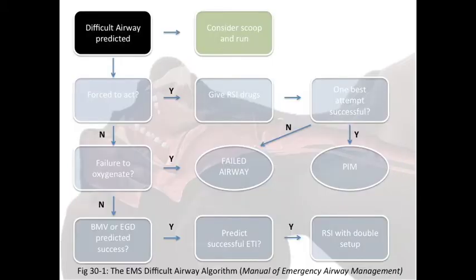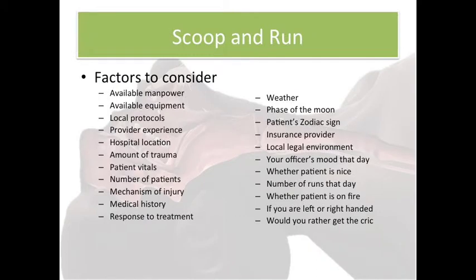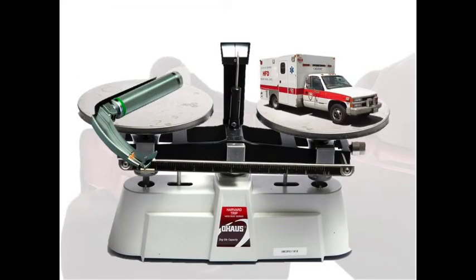Now once we've evaluated a patient for a difficult airway, our next decision we need to make is whether or not we need to scoop and run. Now there are a million reasons to scoop and run a patient, some better than others. And this is a pretty hot topic in pre-hospital medicine right now. But I want to try to give you some evidence to help guide your decision making.